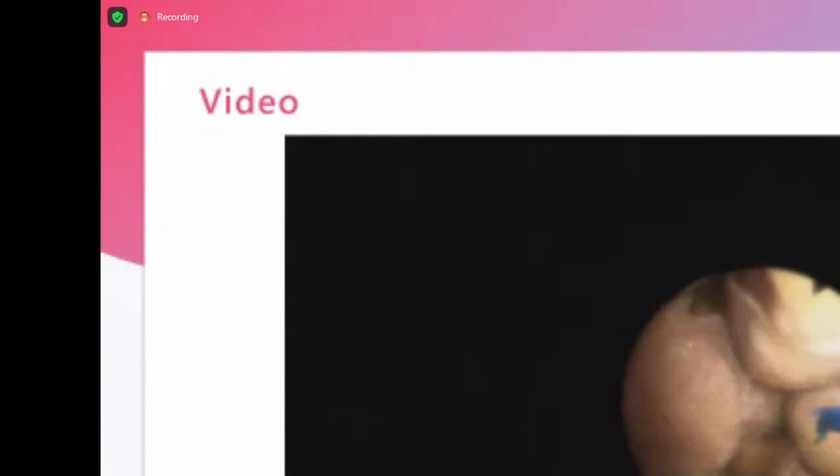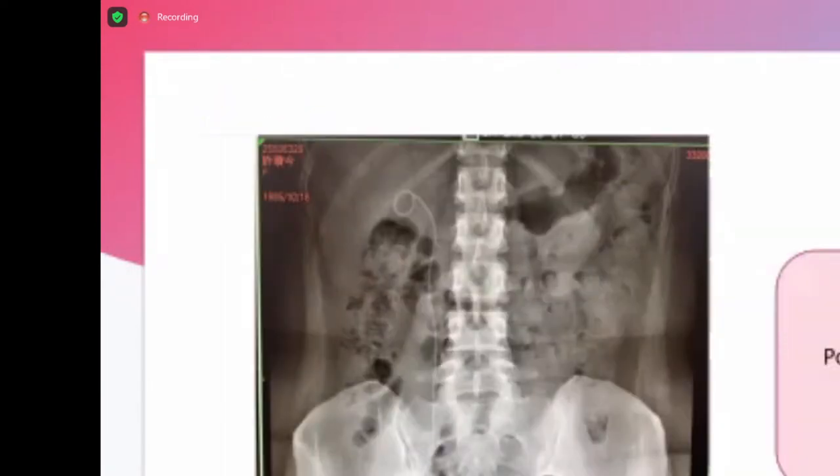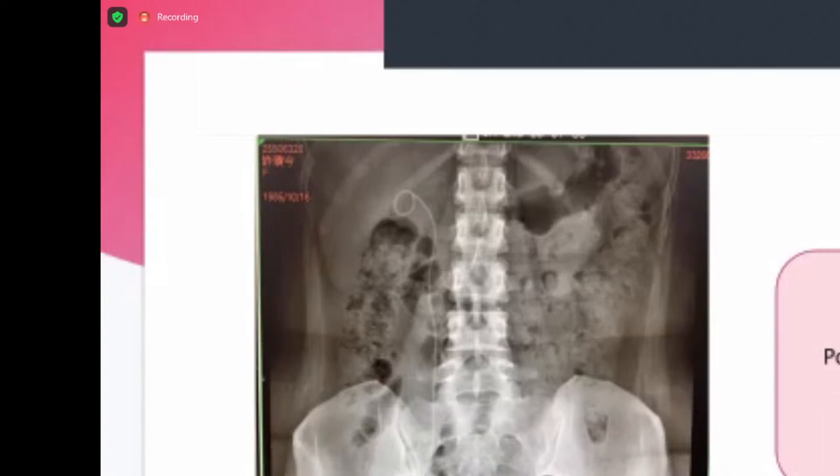But when we perform this surgery, we need to be careful not to injure the renal parenchyma or the vessels, because that will increase the risk of bleeding, and the bleeding will blur our surgical field. So we only incise the neck as large as possible. One month after the surgery, we checked the KUB, and you can see there are no residual stones in the upper pole calyx, but the double J had migrated up the ureter. So we removed the double J with the ureteroscope.